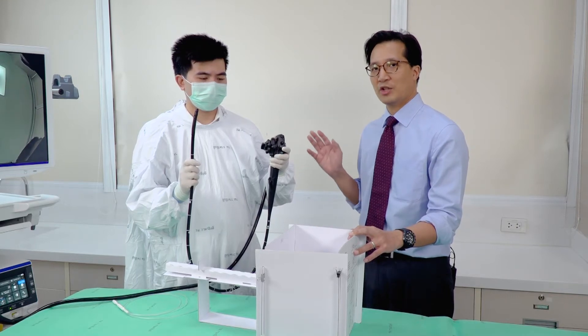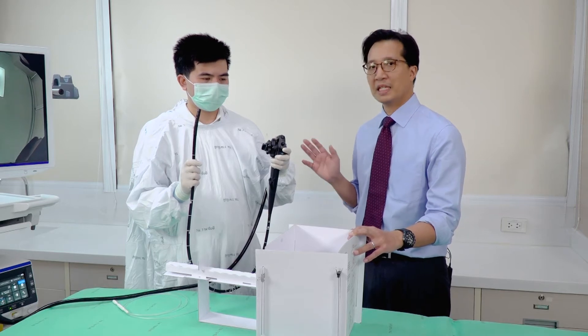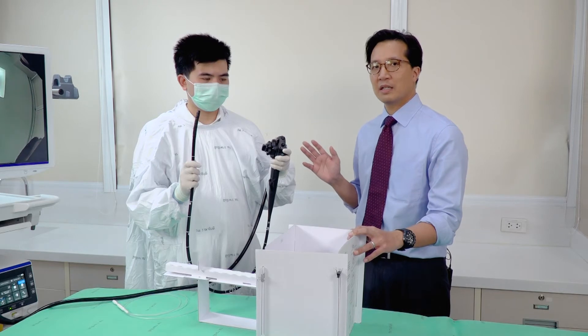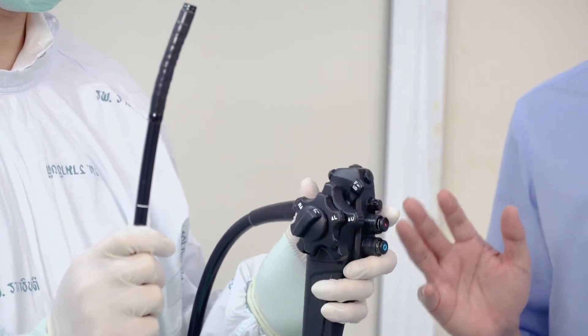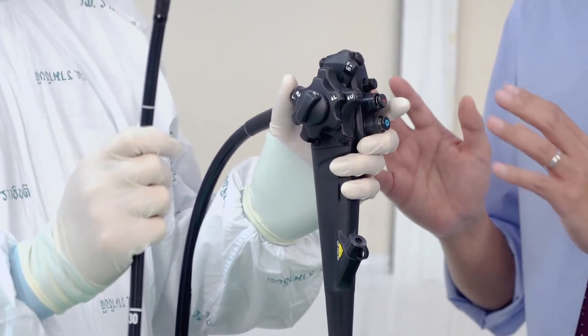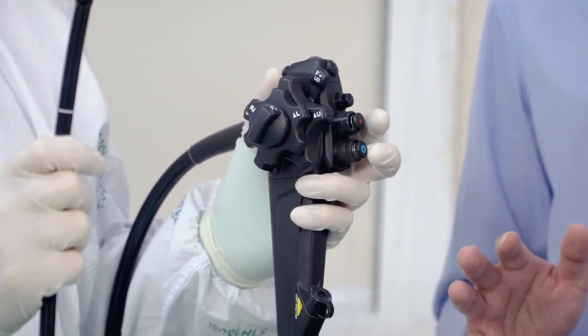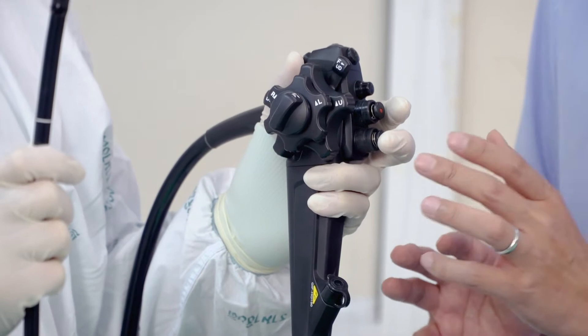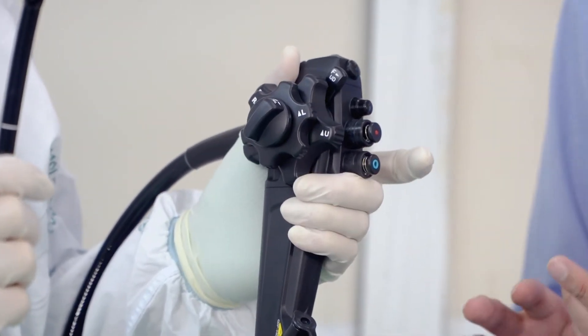Particularly for Asians, Asian ladies, the hands are much smaller, so we may need to adjust the hands. As I'll show in a second, normally if your hand is big enough you can hold it comfortably so that your middle finger on the left hand reaches over to help support the wheels.